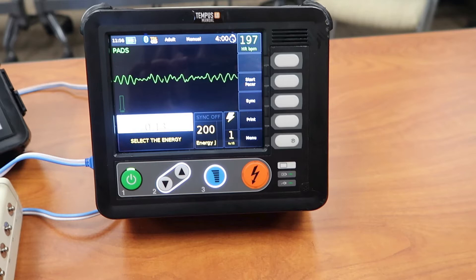Let's say we see the rhythm that you're looking at right now, which is ventricular fibrillation. Ventricular fibrillation is a rhythm that we as EMS providers are taught to defibrillate.